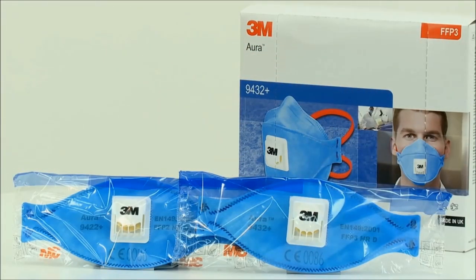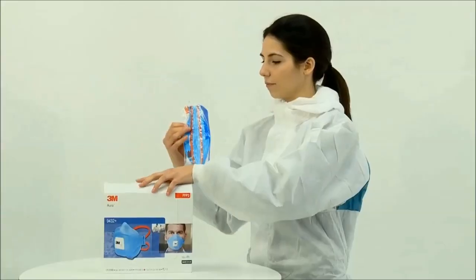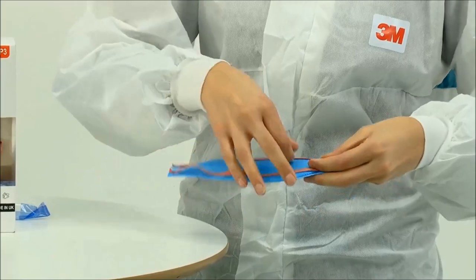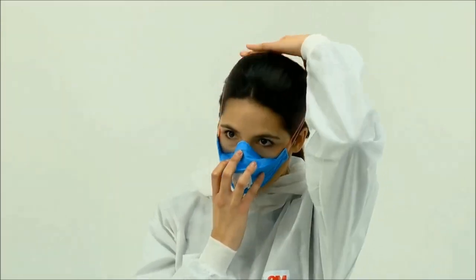Next up, the FFP3 face mask 3M Aura is a disposable respirator valved. It is a flat fold disposable P3 respirator offering reliable, effective protection against higher levels of fine dust, mists, and metal fume. Low breathing resistance filter technology makes for easier breathing through your shift, and an ingenious 3-panel design accommodates greater facial movement during speech, making it much more comfortable to wear.